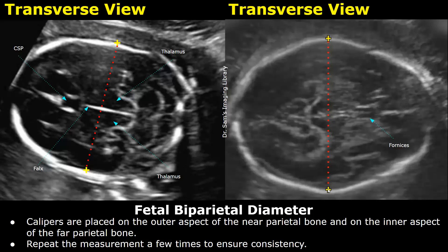Try to place the calipers at the center of the fetal head and keep a straight line. You can repeat the measurements a few times to ensure consistency in obtaining the BPD.